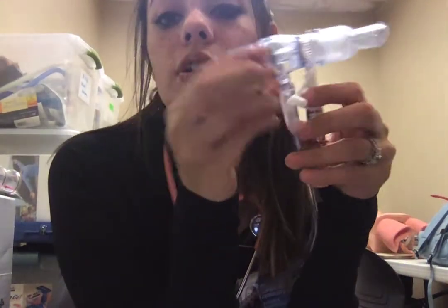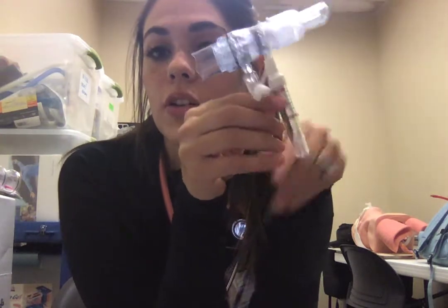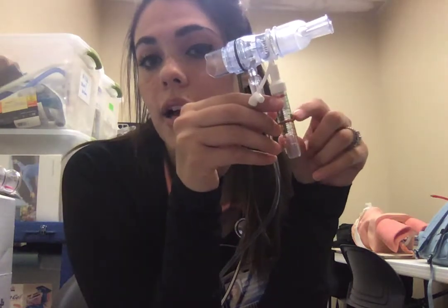I'm going to instruct my patient to inhale as they normally would and exhale forcefully — a little harder than they normally would — to meet those lines up.